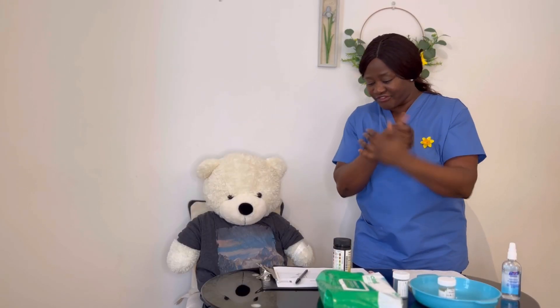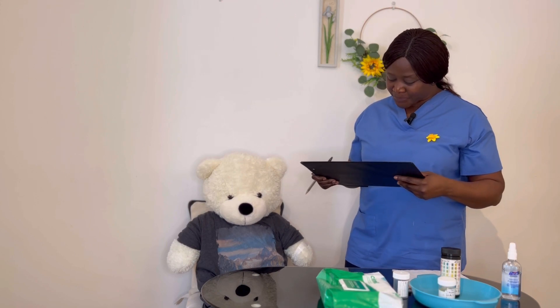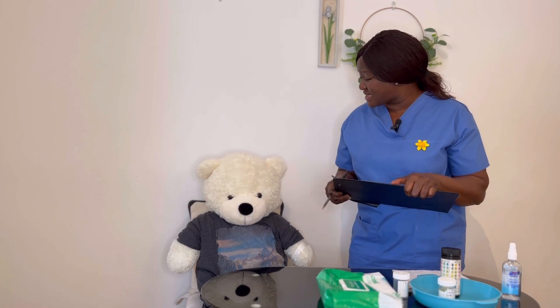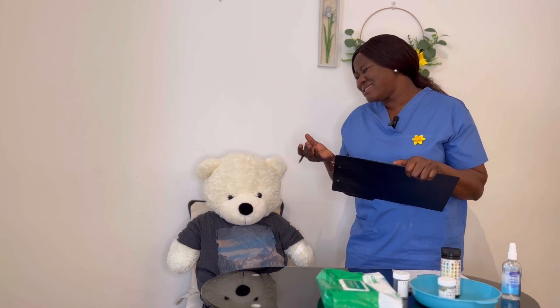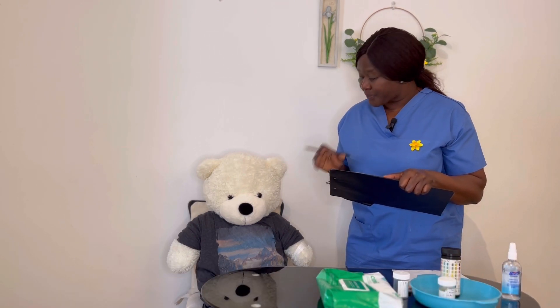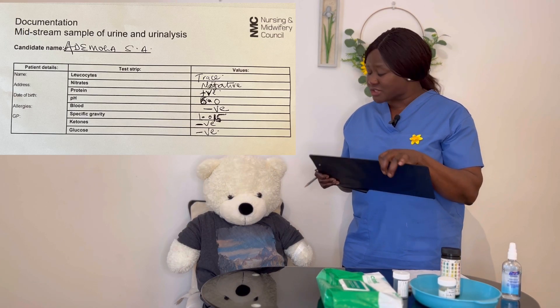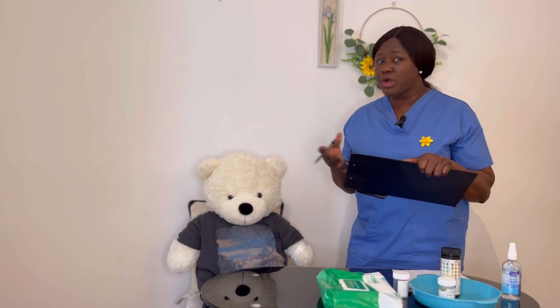Going back to James to relay the findings. Hello James, I'm back — I'm done with the urine test analysis. Every other result is fine, apart from the fact that you have a positive result for protein. What that means is we can have such cases in some cases of hypertension, heart failure, or some kidney impairment. I want to assure you that this is not a definitive diagnosis — this will be escalated to your doctor. I will send a urine sample to the lab, so a detailed analysis from the lab will give us a definitive diagnosis. You also have a trace of leucocytes, which might be a sign of some form of urinary infection — but it's not definitive, like I said.